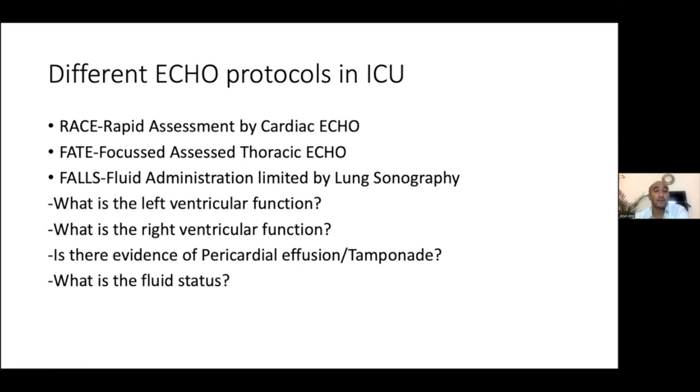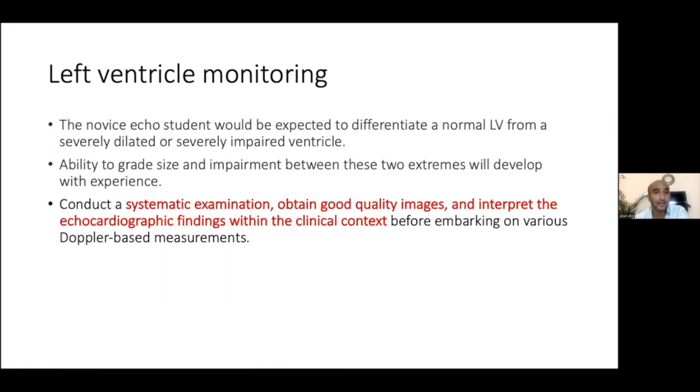The main important questions that we need to answer while we're using echocardiography for monitoring are: what is the left ventricular function? What is the right ventricular function? Whether there is evidence of any obstructive shock, and what is the fluid status? Let's quickly go through them. So, left ventricular monitoring.